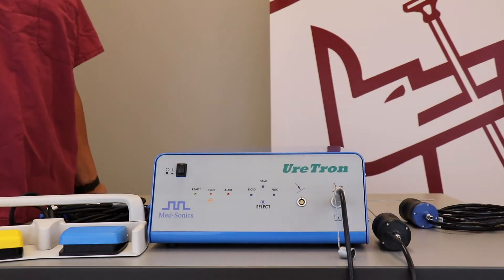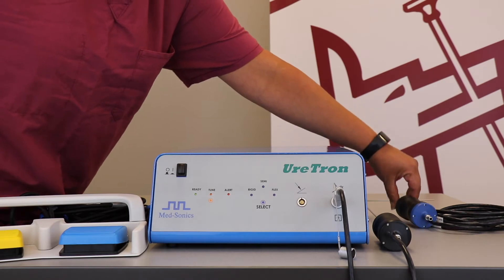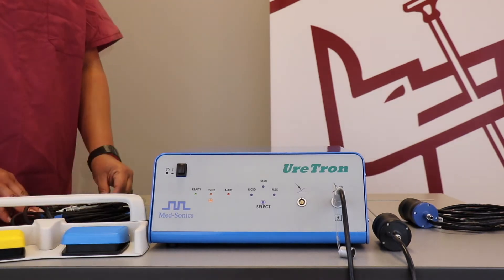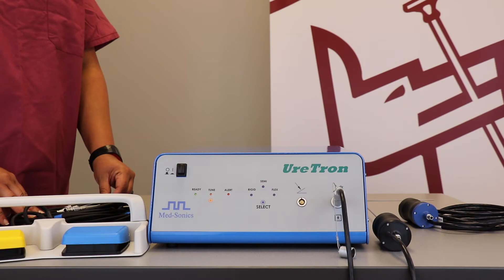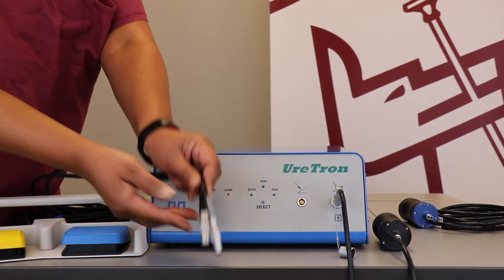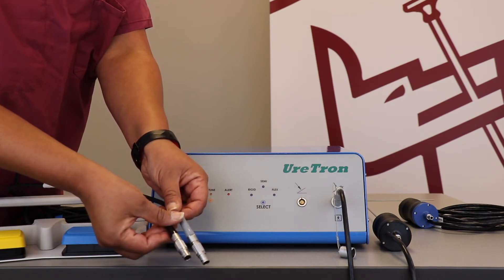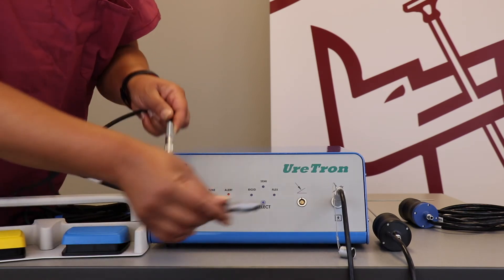When using the semi-rigid handpiece, it is assembled the same way as the rigid handpiece. After plugging in the handpiece, you will then plug in the dual foot switch. As you can see there are two cords; however, they can be used interchangeably. They will now be plugged in by lining up red to red.